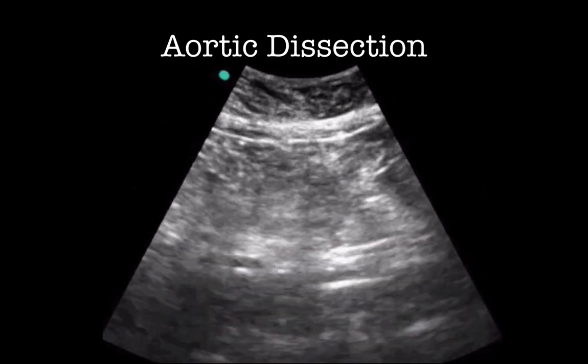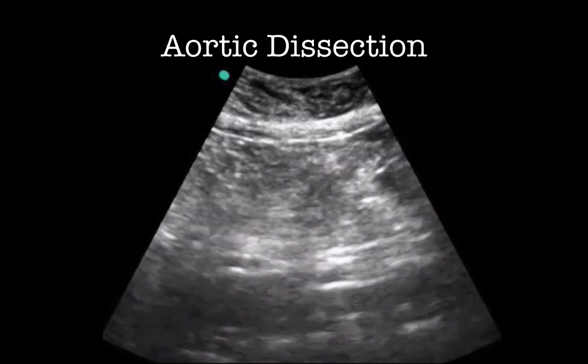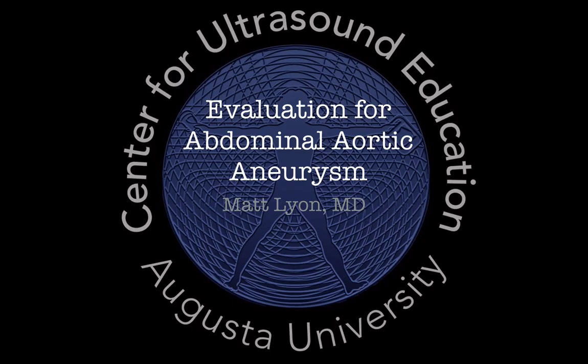Here it is in long axis. You can see that intimal wall, how it is separated from the other two parts of the aortic wall. I hope this helps you understand how ultrasound can be useful in the evaluation and the detection of an aneurysm.